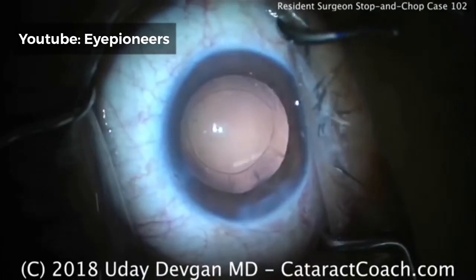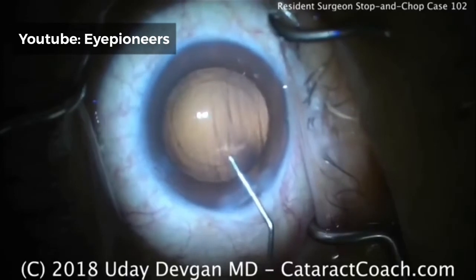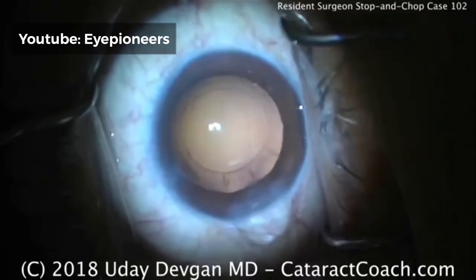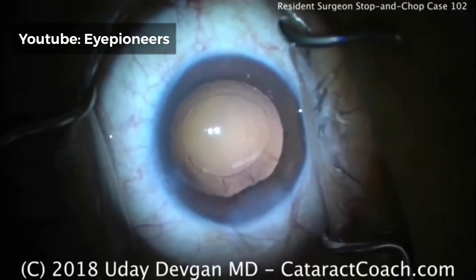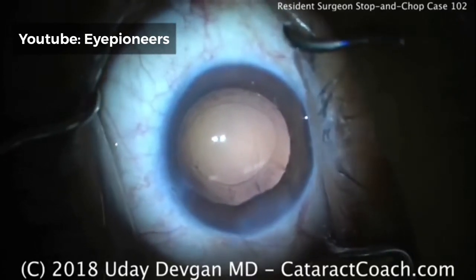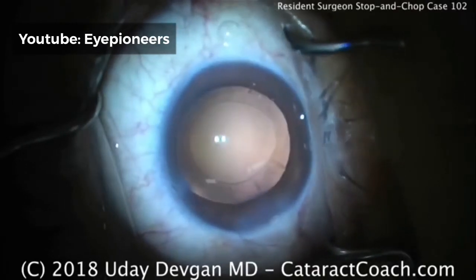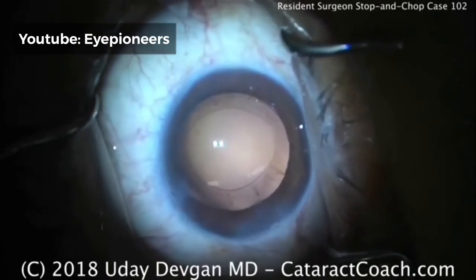Time to fill the eye with viscoelastic — cohesive viscoelastic — filling the capsular bag nice and deep. Then we're going to load up a single-piece acrylic monofocal lens. For county hospital patients, we put in mostly monofocal IOLs; very rarely do we put in a multifocal lens. On some occasions residents will do toric lenses for patients with higher degrees of astigmatism. Our typical technique is a monofocal single-piece acrylic lens, aiming for a target between plano and about minus one, since a little bit of myopia is really a blessing in a world where we do so much with near vision.